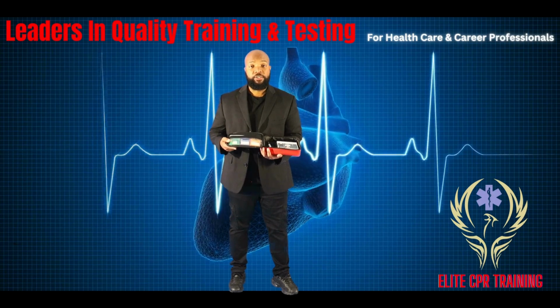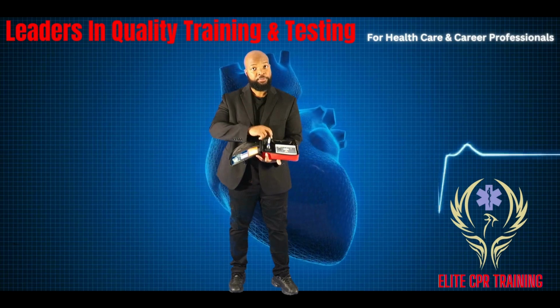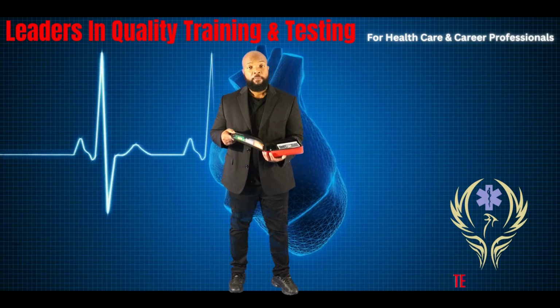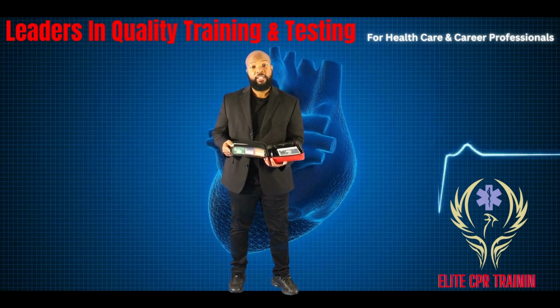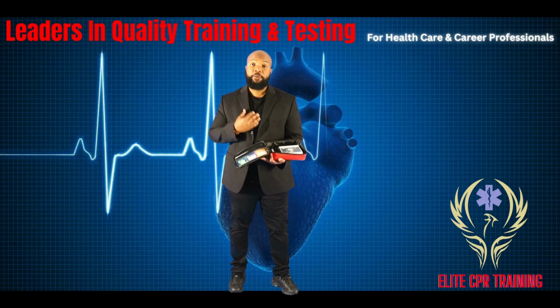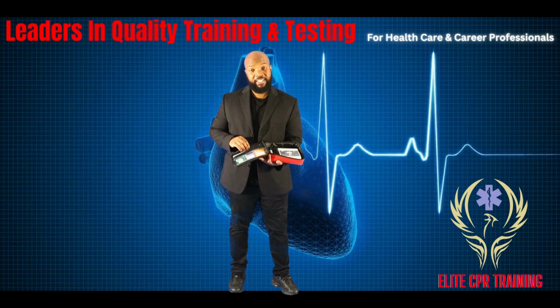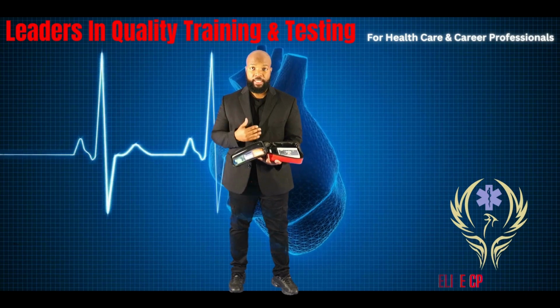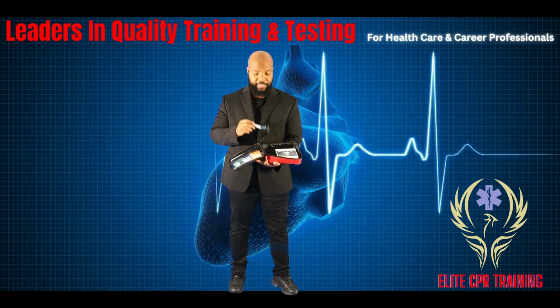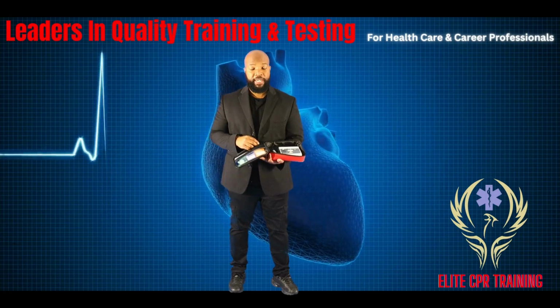Most AEDs should already be equipped with a razor and another set of pads. Before you apply the pads onto the patient, you have to think of these few considerations. If the person is wet, you want to quickly wipe off the chest because the pads may not stick if they happen to be wet. If the person has a hairy chest, go ahead and shave that individual to remove any hair that you're going to apply the pads on.